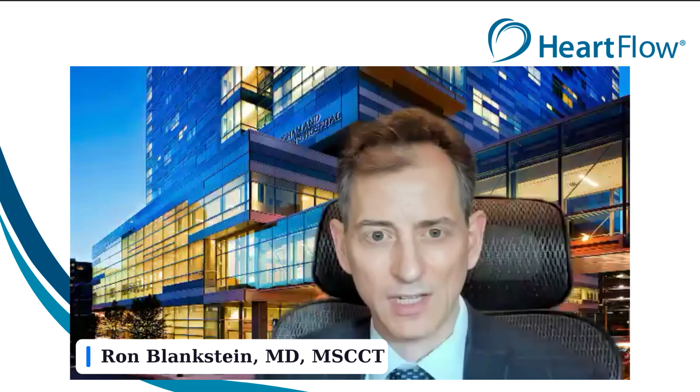Yeah, it's a great question, Jonathan. People ask this a lot: what's more important, the percentile or the absolute amount of plaque? And the reality is they're both important. So in the short term, whether it's a calcium score or CT, the overall amount of plaque you have is going to be the strongest predictor of risk. If you have a lot of plaque, you're always going to have higher risk. But percentile helps us identify folks who are on the extremes better.